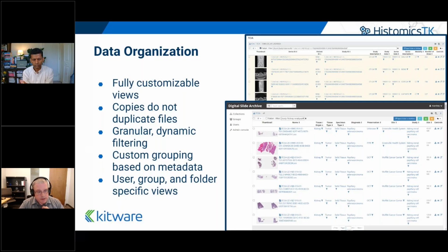While the focus of the Histomics platform is whole slide images and digital pathology, we do handle radiology files too with plugins that Kitware makes, so you can use VolView to visualize those. And in my back image, I'm showing some radiology data that's been organized by DICOM series ID and studies ID. And you don't want to see every individual image of a CT scan, so it's showing a representative image and then getting you a link there.